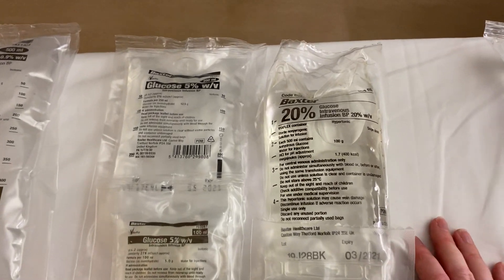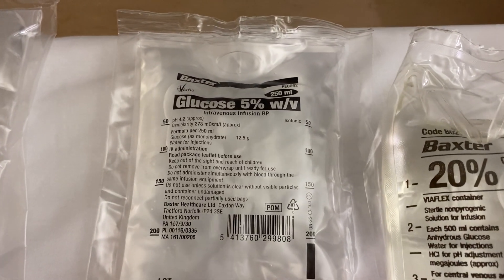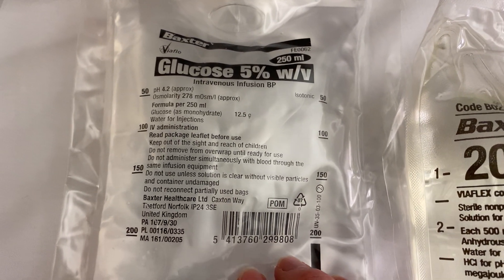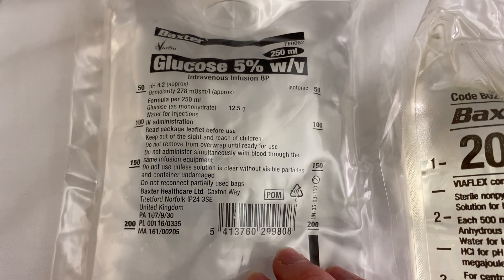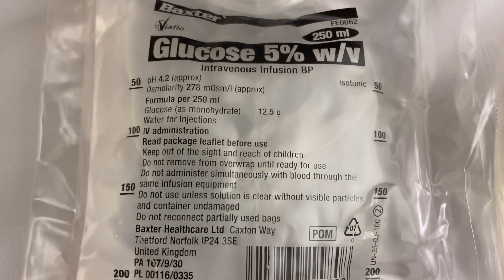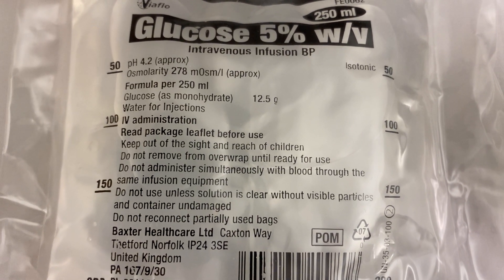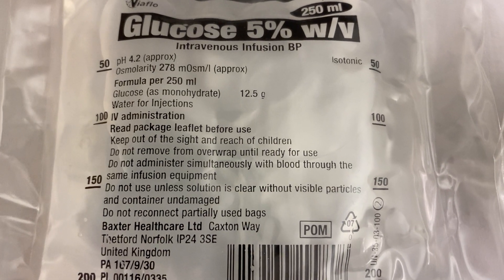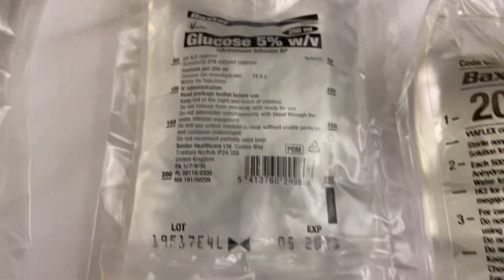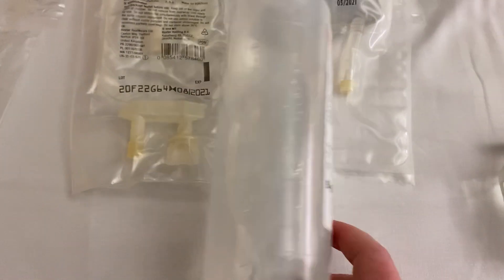Moving on to glucose solutions — you can get 5%, 10%, 20%, and 50% in various volumes. The 5% is what we use when diluting drugs. In ICU they give most drugs in sodium chloride or glucose to avoid giving too much sodium or chloride. This 250 ml bag of 5% glucose has a pH of 4.2 — quite acidic — and contains only 12.5 grams of glucose, which is why we don't use 5% glucose to treat hypoglycaemia; we use higher concentrations for that.